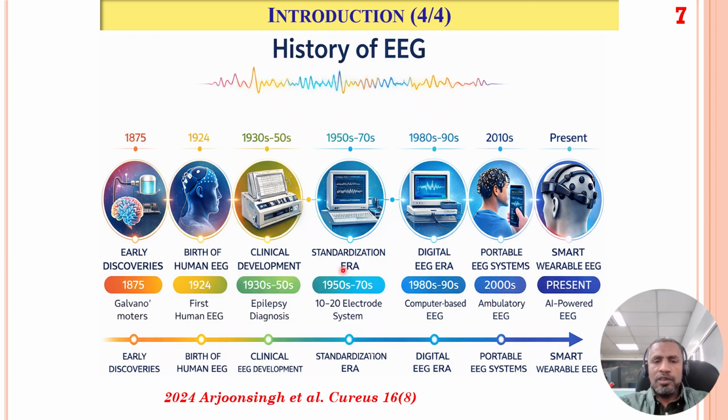It was standardized, and it also had the 10-20 electrode system. In the 1980s up to the 1990s, this EEG was very advanced. It was digital and computer based.